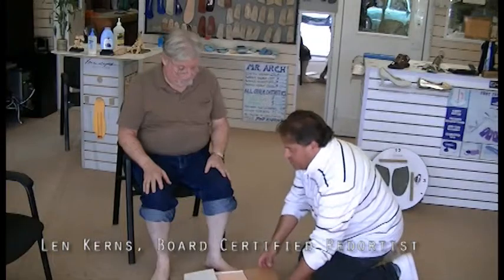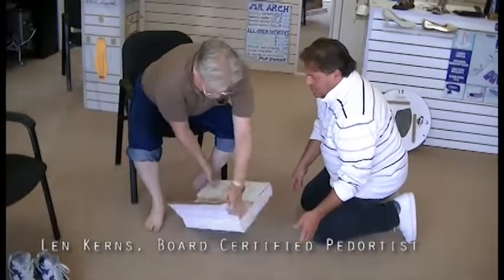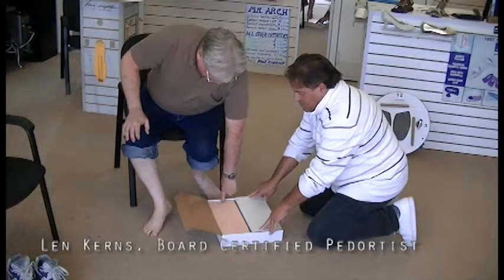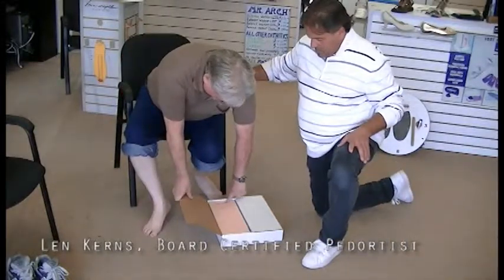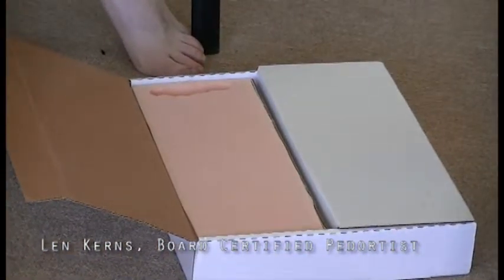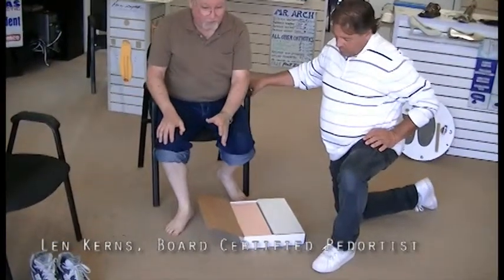It's a lot easier. Okay, so the foam box goes right between the patient's feet, and we're going to use the left one for this demonstration. And before we start, I made a finger mark in here just to show that the whole idea is this foam, the foot can slide all the way to one side and all the way to the other. So as Mark demonstrates, to hold the navicular talus joint in the proper place as you're pushing it down, you're also using it to steer it straight down so you don't go to the left or to the right in the foam.